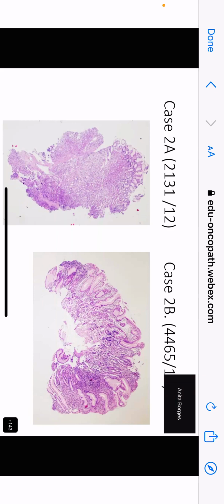Right? So Dia is right that this is gastric body mucosa. Suveta also said that, but Suveta didn't know why she was calling it gastric body mucosa. Body and fundus, there's nothing to choose from. They look the same. This is gastric body mucosa, which is what you also see in the fundus. You have very short foveolae and the length of the glands is very long.